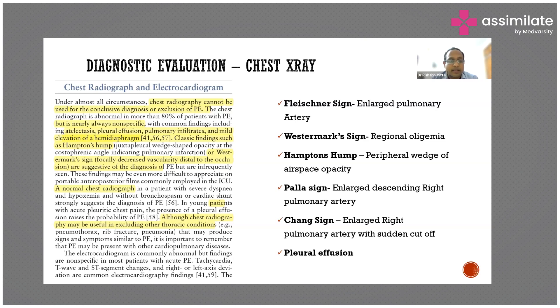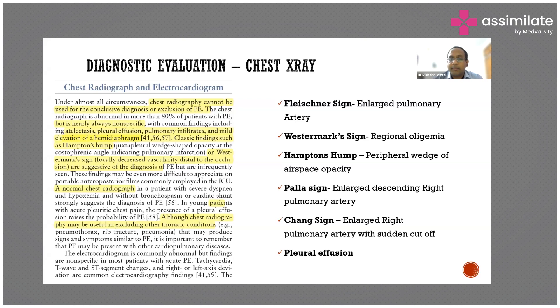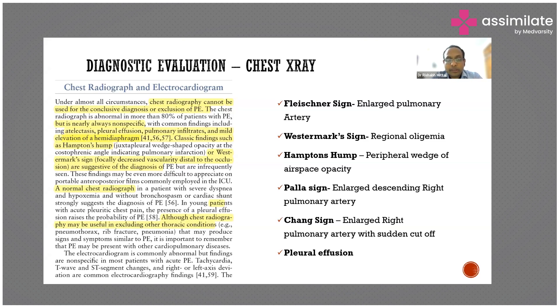The first classic sign is Westermark sign. It is a regional oligemia — there is decreased vascularity distal to the occlusion. The pulmonary embolus occludes the vessel, so distal to that occlusion there is no flow. On x-ray, there will be decreased pulmonary vasculature distal to that embolus. That finding is called Westermark sign.